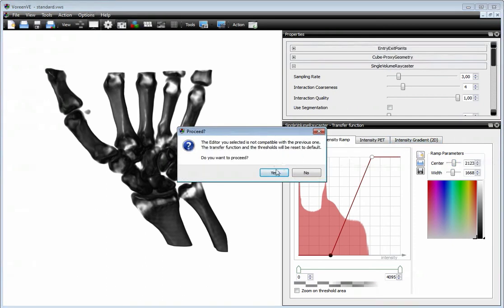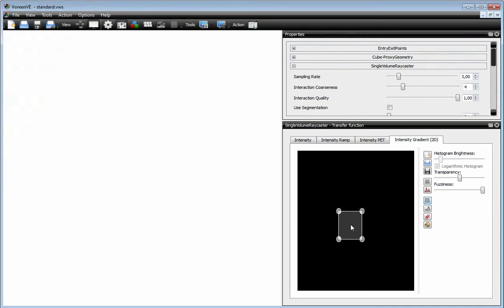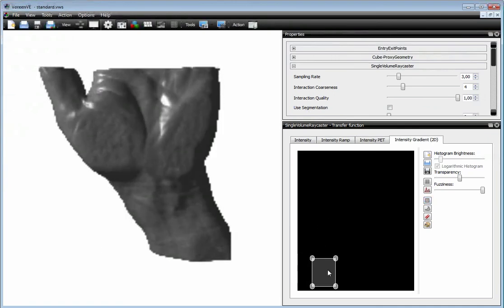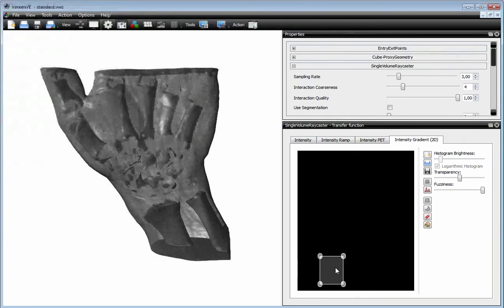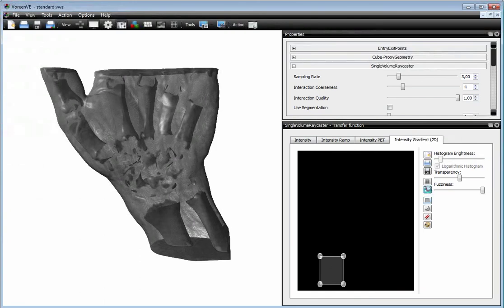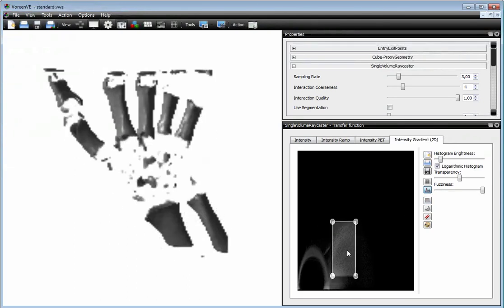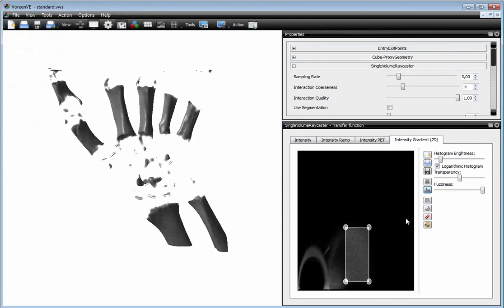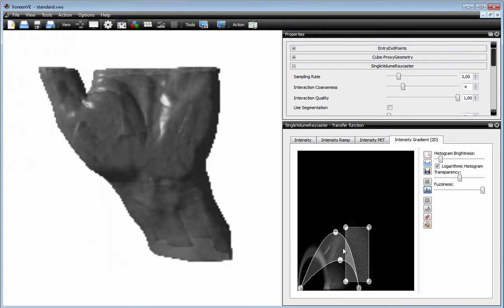The intensity gradient is a conventional 2D Transfer Function, so you can drag primitives on the display, and then you get the gradient based transfer function. You can also calculate the histogram, and then you can see the 2D histograms of the gradient transfer function.